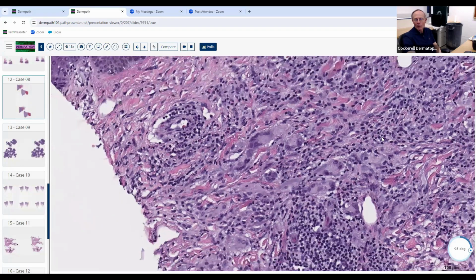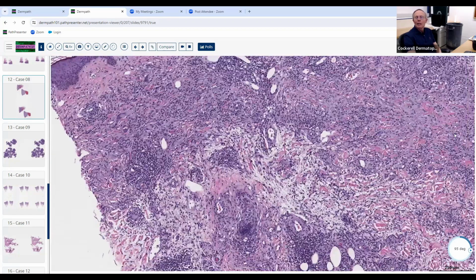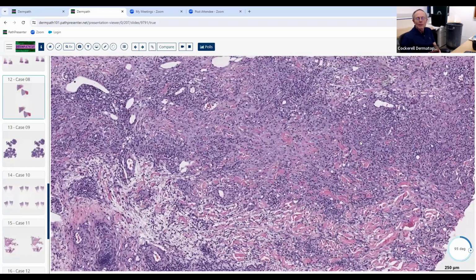Now, there's one other scenario where we get granulomatous inflammation in patients with cutaneous T-cell lymphoma, and usually these histiocytes come in, they develop these large multinucleated morphology with maybe 10 or 15 nuclei. They're not only engulfing the atypical lymphocytes, but they're also engulfing elastic fibers, sort of like what you see with cutis laxa and some of these other conditions. And that's called granulomatous slack skin syndrome.